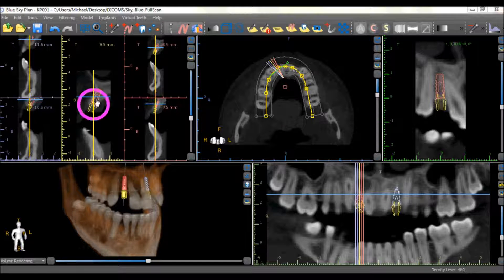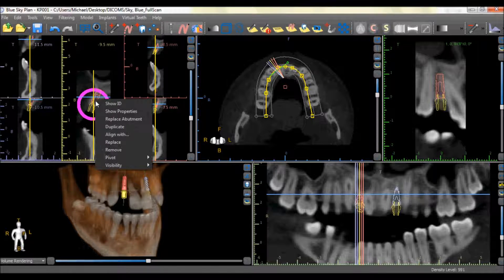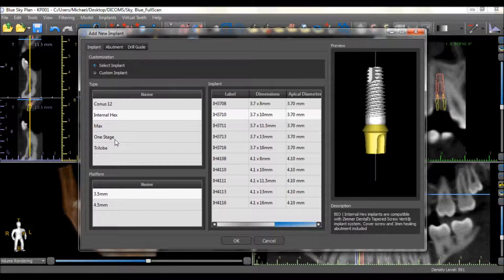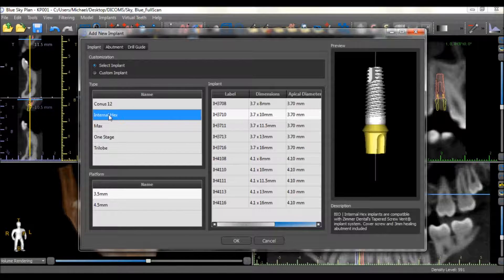An implant or abutment can be replaced by right-clicking on the implant and choosing the Replace option. The new desired implant or abutment can then be selected from the list.